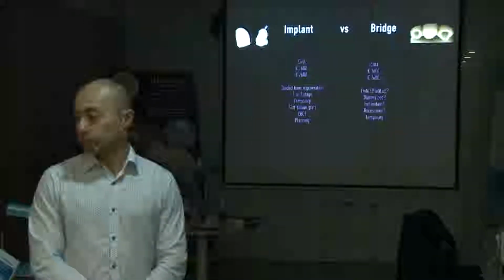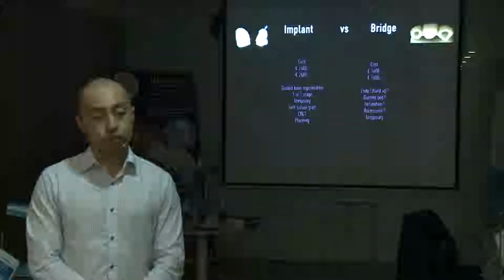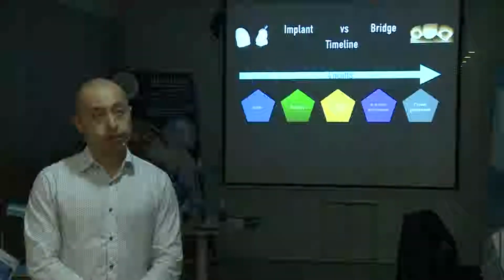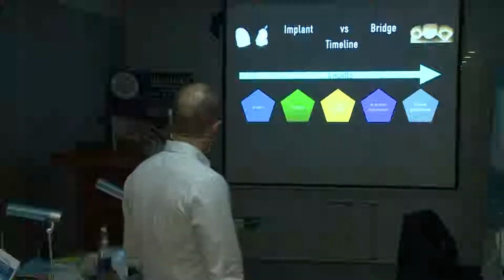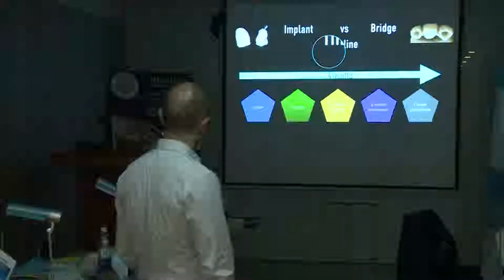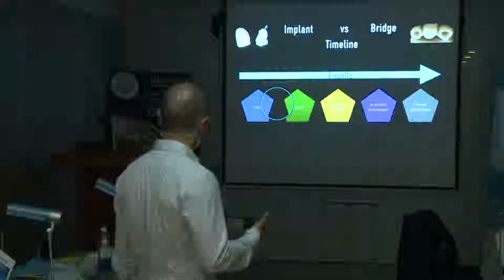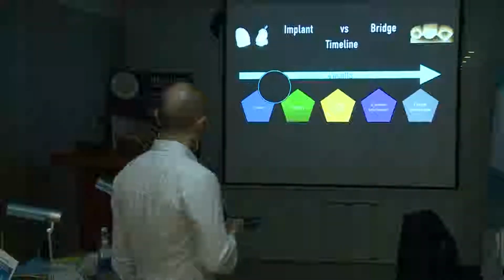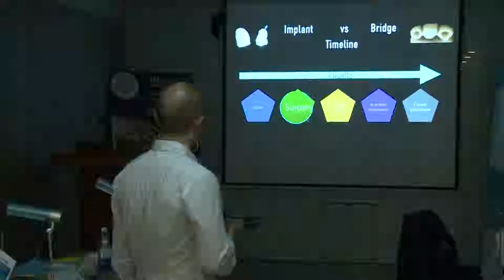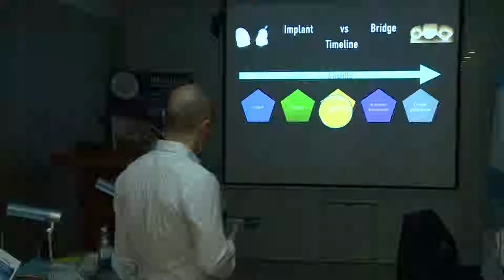Once a patient comes in for me at intake for the treatment, we discuss the treatment, the cost, the length, what I should do, and then we do the surgery. I remove sutures after 2 weeks, so in this part we're already at 4 weeks. And at 8 weeks I do my impression, and 4 weeks later I place my crown. This is the situation when I can go one stage without GBR. So there's almost 4 months from starting point to placing the crown.